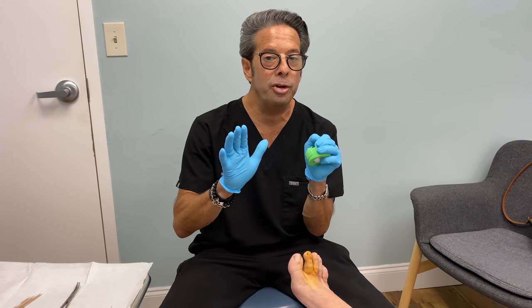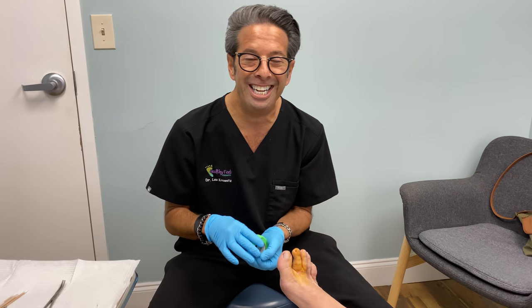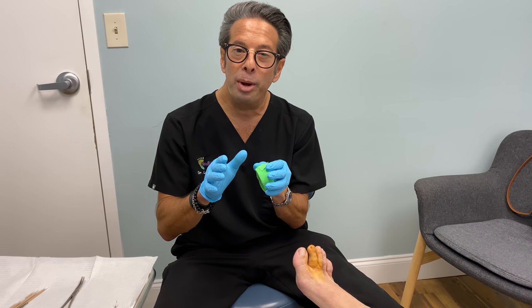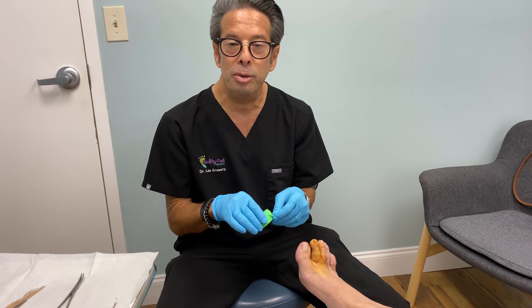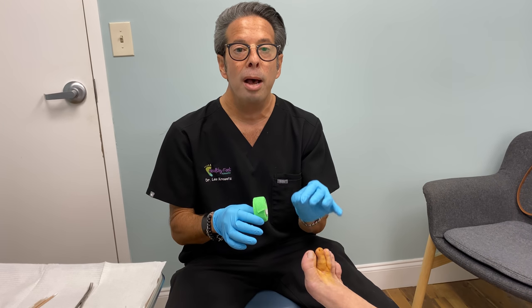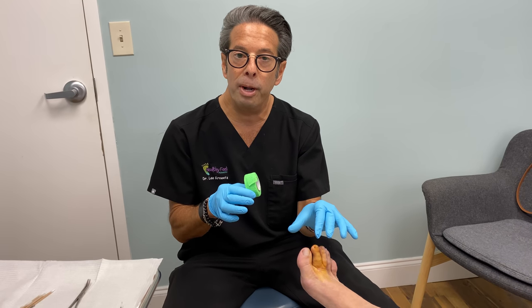She wanted me to just cut her toe off. I told her no, that's too radical. Let's just take the nail and that should be it. So we're going to take the whole nail off of there, and that's actually a great solution. But the first four weeks it's sore because it's hitting the end of the toe when she's in a shoe, so it's going to be a little tender because it's going to be a little bit raw.